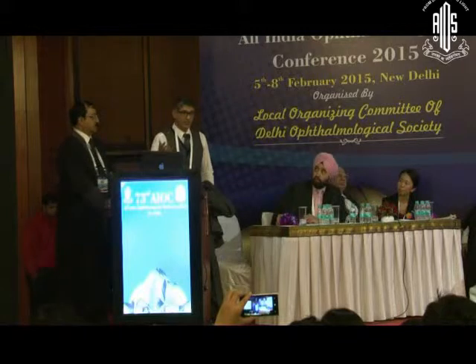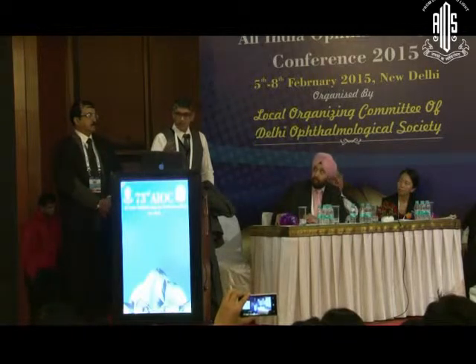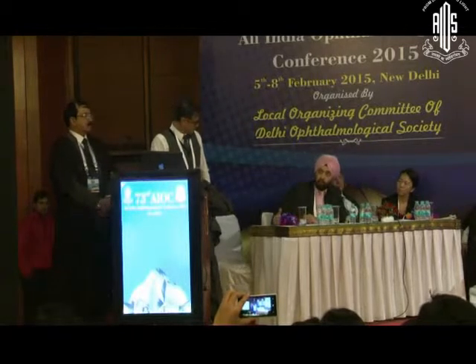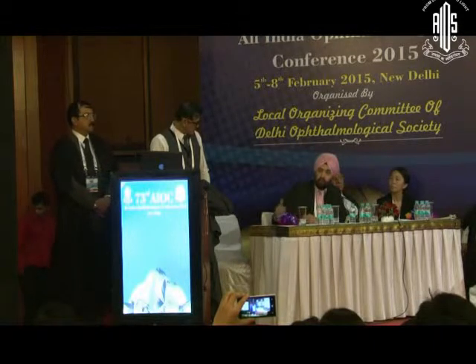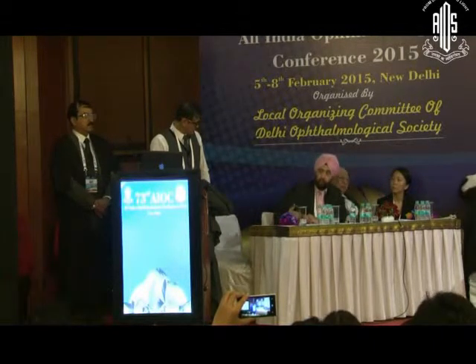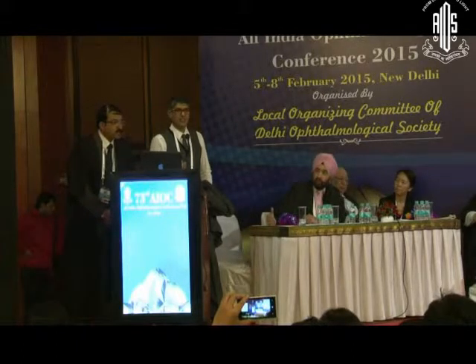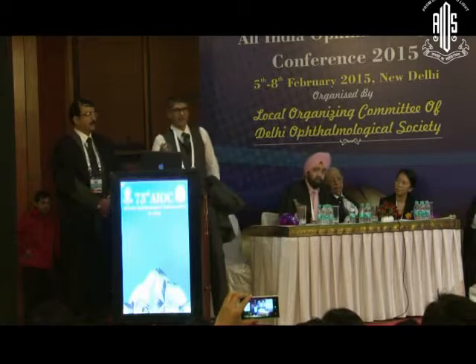But even then, it would have been a little better. So, how are you aware of the post-operative behavior of an ICL working as a piggyback lens? There are reports of various other materials that are used which give you good results in a piggyback. So, why not go with the conventional thing? Put one lens, take out the ICL, put one lens, and not make a heroic surgery of the entire thing. Just do a normal one. Acrobatics, sir. It's not very difficult. In fact, acrobatics is very easy. I do it every day. Yeah, but you have a lens which is.